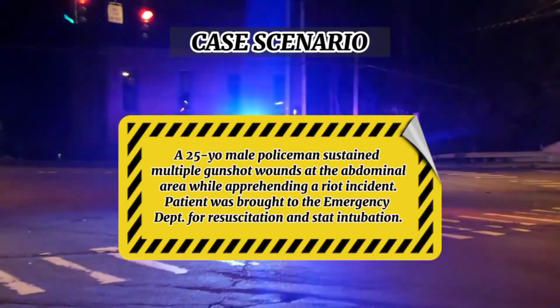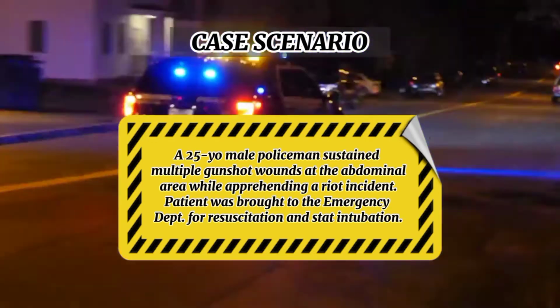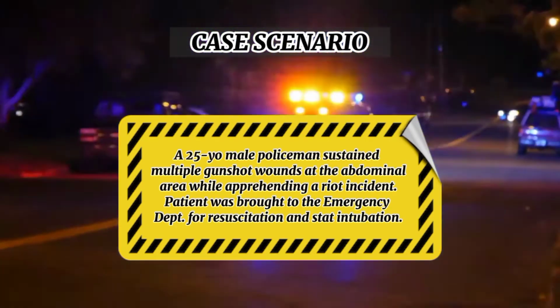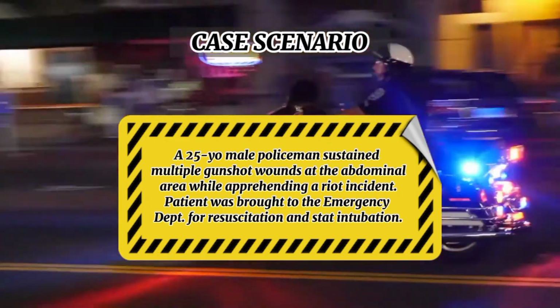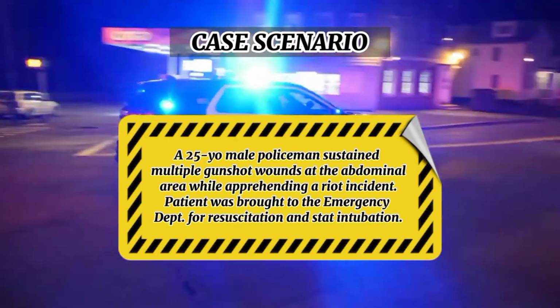Good day, I am Clinical Clerk Dave Marquez, and today I am going to demonstrate how to perform an endotracheal intubation. For our case scenario, a 25-year-old male policeman sustained multiple gunshot wounds at the abdominal area while apprehending a riot incident. The patient was brought to the ER for resuscitation and stat intubation.